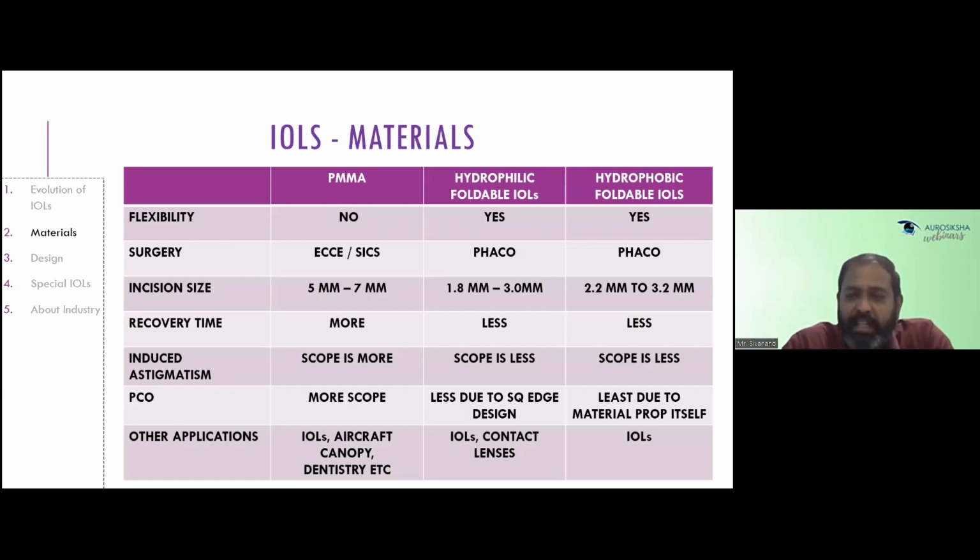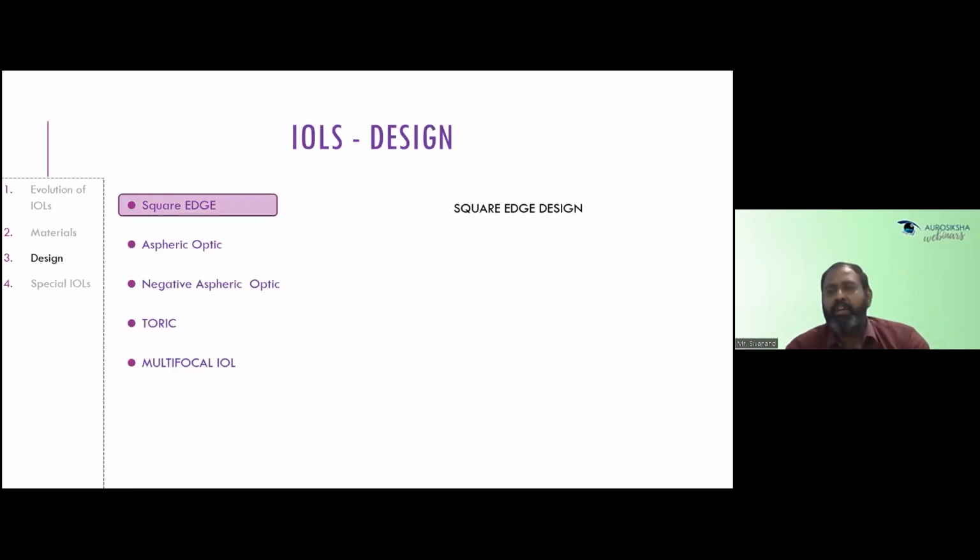And if you see the applications, the hydrophobic material is applied only for intraocular lenses, but the hydrophilic and the PMMA are used in multiple industries. Now let's get into, so I have covered the materials part of the IOLs.